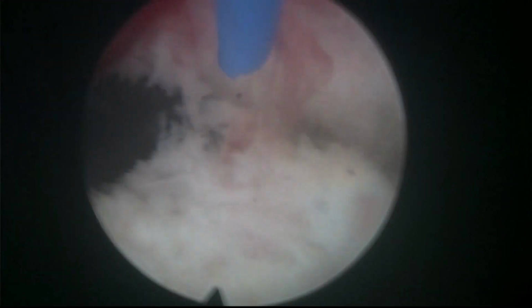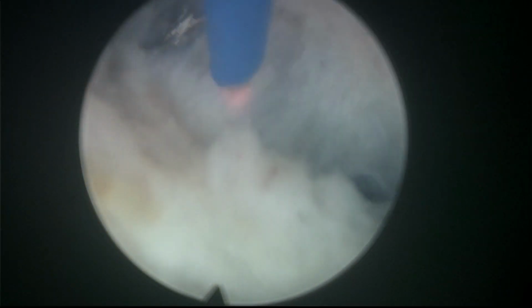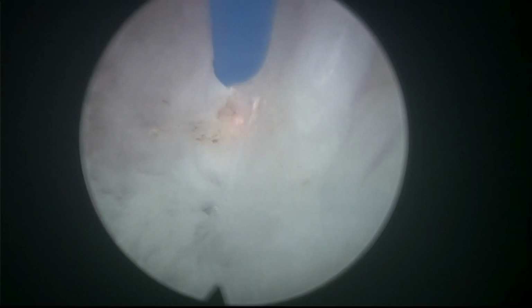So here you see that's a small vessel near the bladder neck. Now we entered the bladder at 12 o'clock, and again I will try to do this circumferential dissection, trying to judge if the plane is good enough or if it's too deep. There's some fibrosity there. It's not a beautiful plane, but there are some hints.